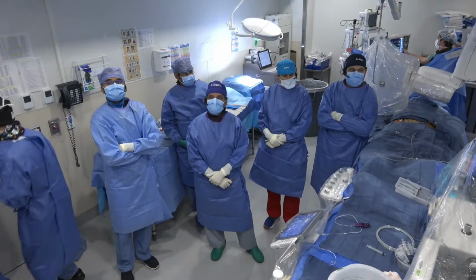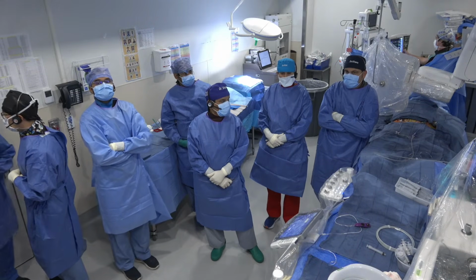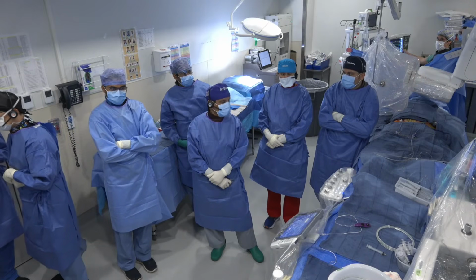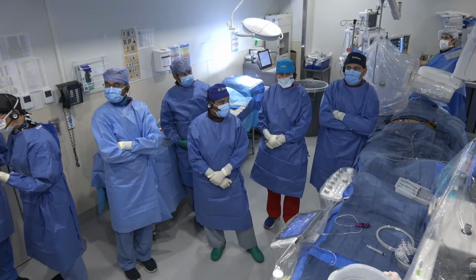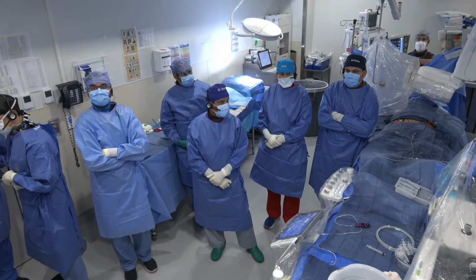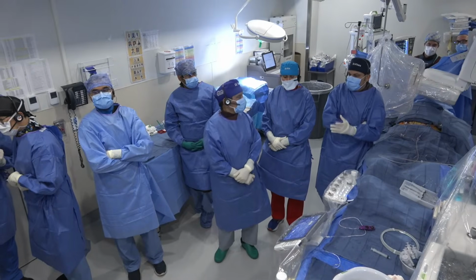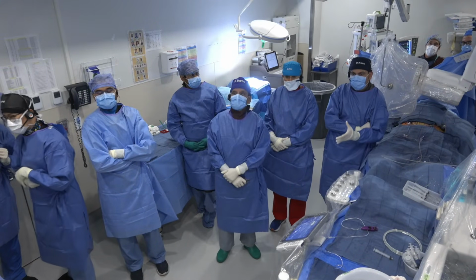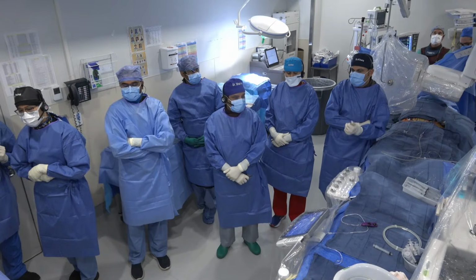Yeah. So, I'll be devil's advocate here. I think 95% of our TAVRs are done under minimal sedation with TTE. First of all, quantification of TTE PVL is very different from TEE PVL. So at time 0, when we do a balloon post-dilatation, the PVL almost always looks improved on a transthoracic echo. So pushing for a second valve immediately in the room just makes it harder.